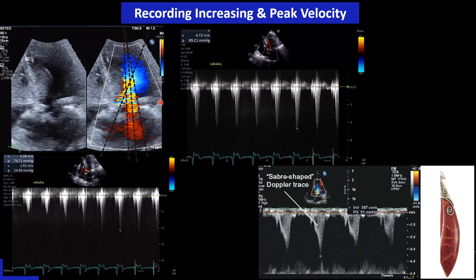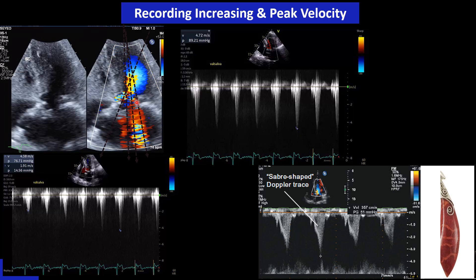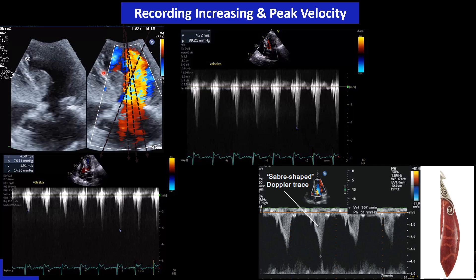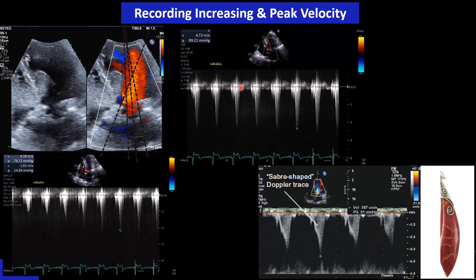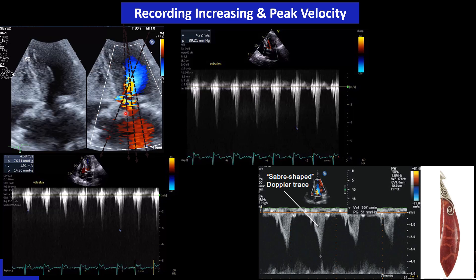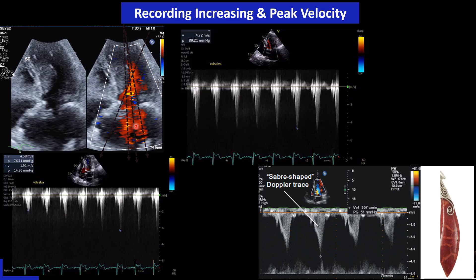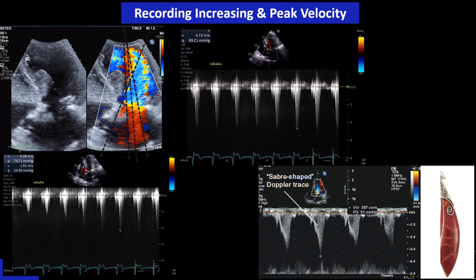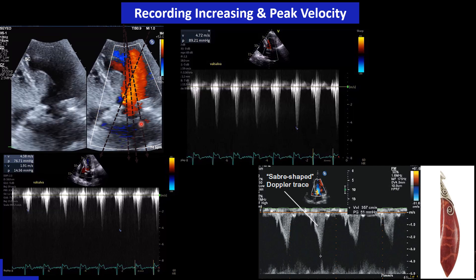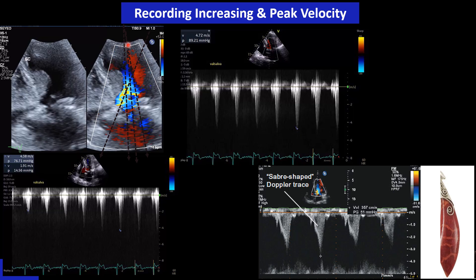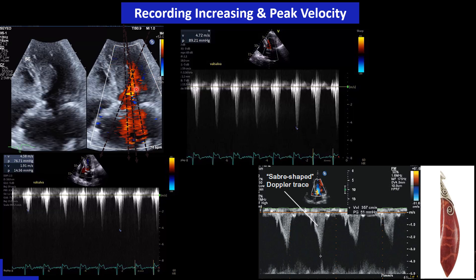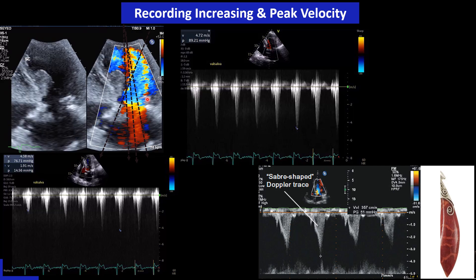We repeat the same maneuver in the apical 3 view. Sometimes in apical 5 we cannot get a very high velocity, but in apical 3 we can catch and record that high velocity, or vice versa. The same principle used for aortic stenosis applies to intracardiac obstruction with the Valsalva maneuver.